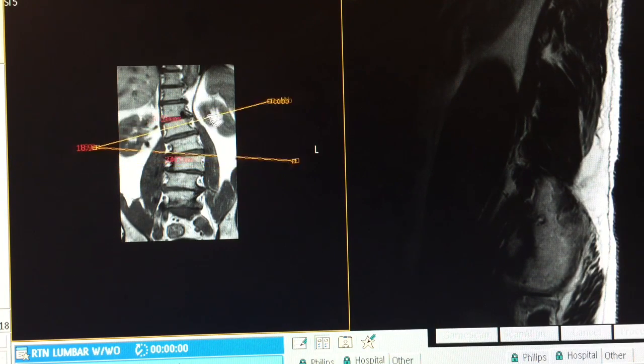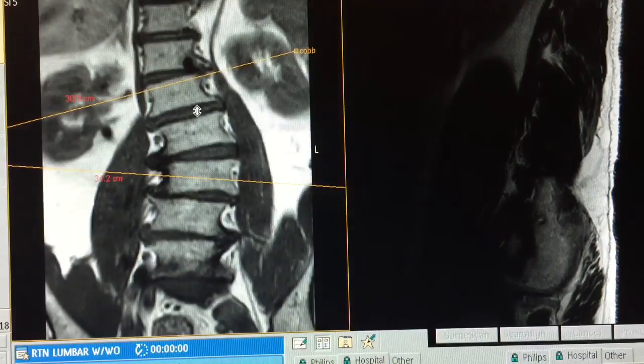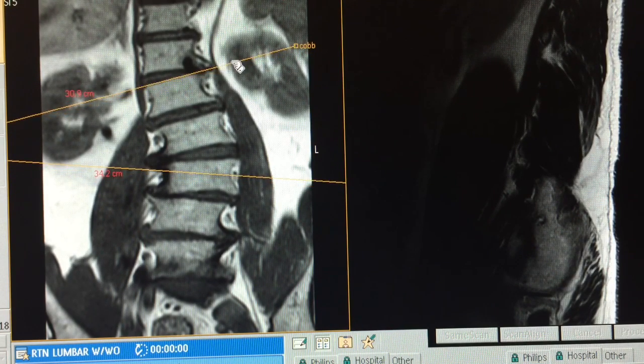You'll be able to move the lines freely. Let's start from the very top vertebra — I need to be aligned with that, which I am pretty well. I'll move it closer here. For the bottom one, I think this is the appropriate measurement position; you could attempt it elsewhere, but for this video it's here, parallel to that ridge.